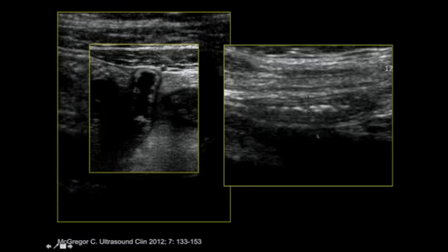She had a right lower quadrant ovarian hemorrhagic cyst, and when we probed with the probe, although she was somewhat tender here, she was exquisitely tender over her hemorrhagic cyst.